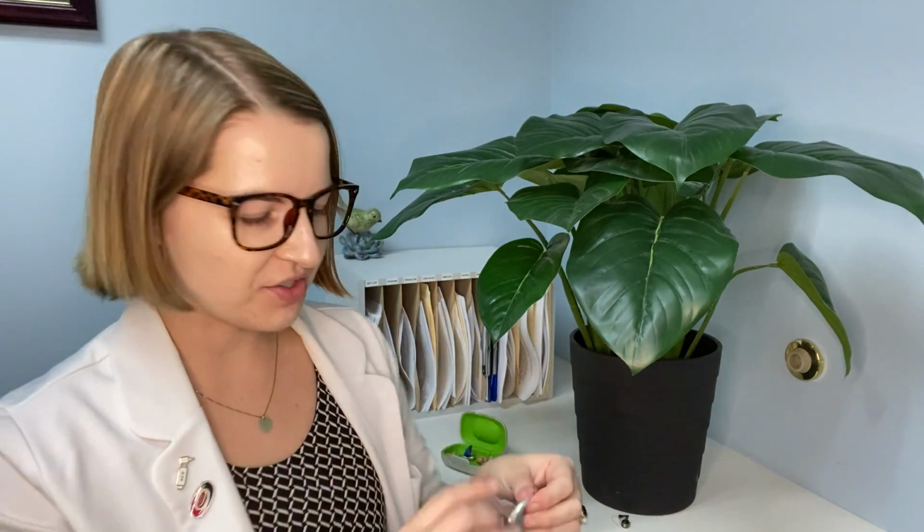And then, of course, there's this big hearing aid, the BTE, and this most commonly comes with a custom ear mold that's molded to the shape of their ear. This is really used for severe to profound hearing loss, where we need lots of power in the sound going into the ear canal, and where we need a custom fitting ear mold to trap all the possible sound in the ear. So I'd say this is probably our least common style in the clinic, although we do have plenty of people with severe to profound loss who are really successful with this style.